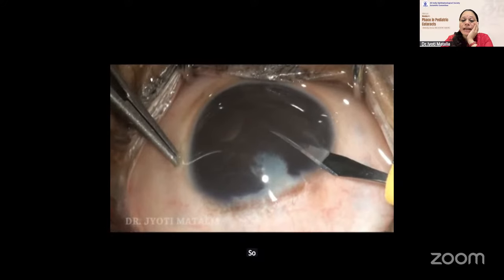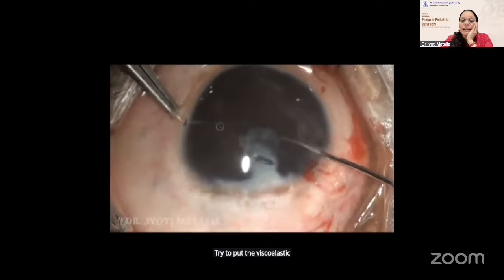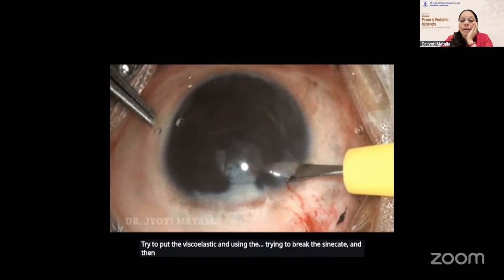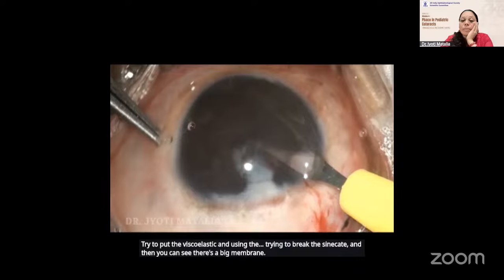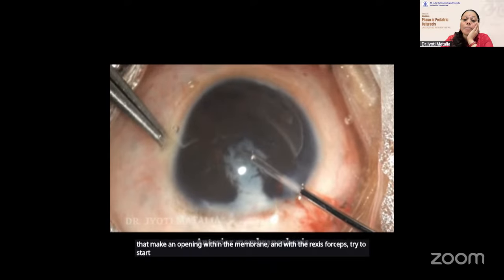So first I made a side port on either side, tried to put in viscoelastic and break the synechiae. And then you can see there's a big membrane. Then I made an opening within the membrane, and with the rhexis forceps, tried to start an anterior membranorhexis.